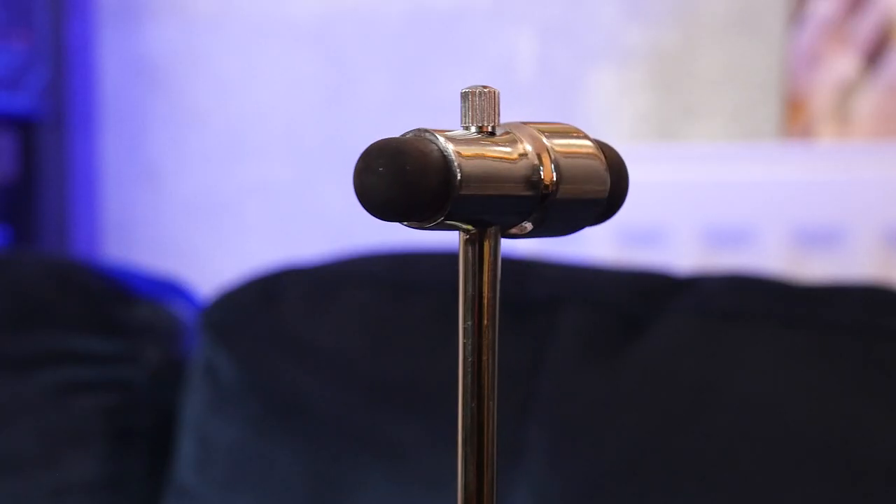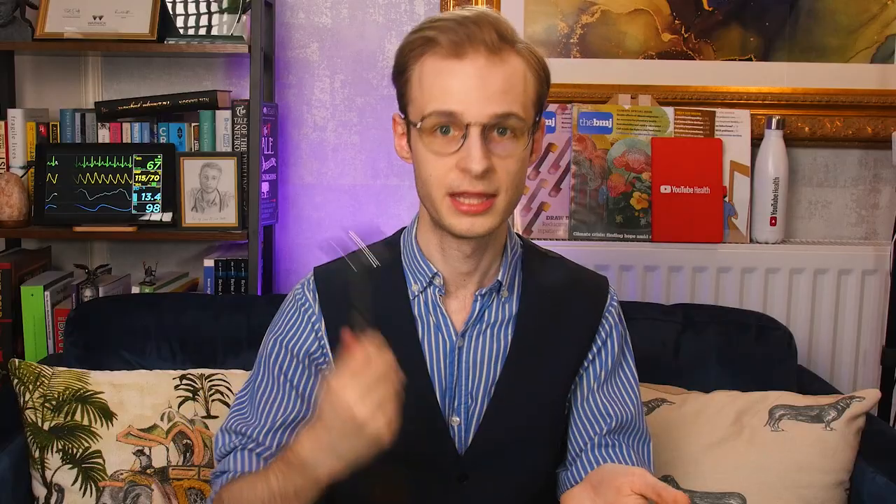Myotonia is extended muscle contraction in response to being tapped by the hammer. And finally, another one I can actually show you is called a Buck hammer. It's a very similar design to the Tromner hammer with a slightly larger second head. It's quite nice and compact so it would fit in a pocket, although you would have to put more force through it to get the same force as with the longer Queen Square hammer.